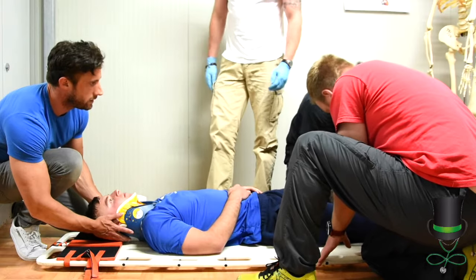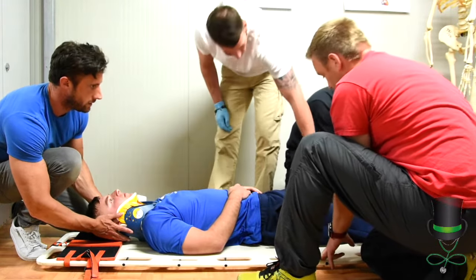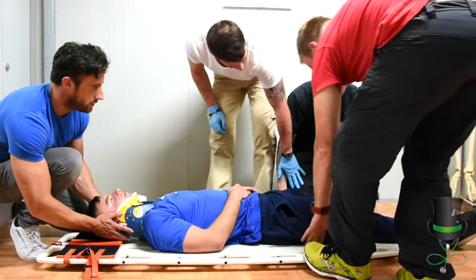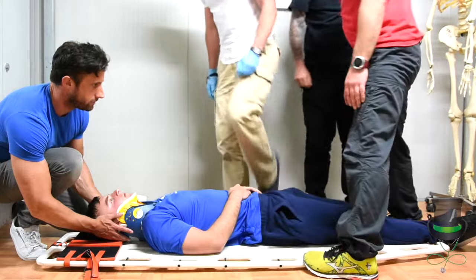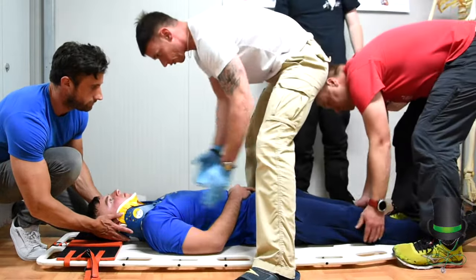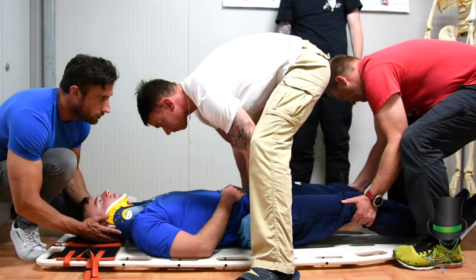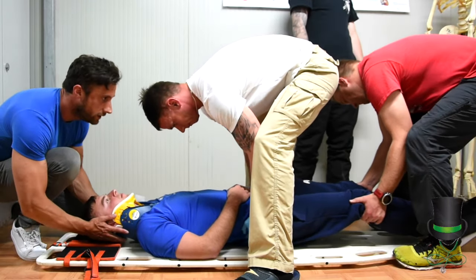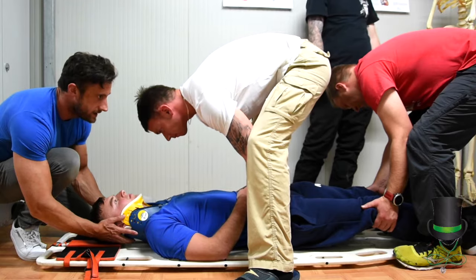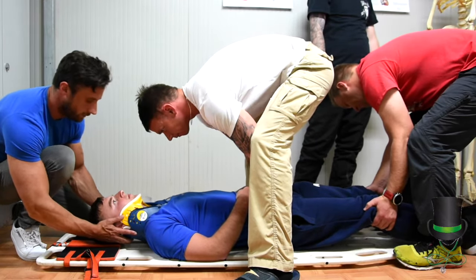This will take standing over the patient, and again the guy at the head will control the movement. We're going to slide the patient straight down and then straight back up to centrally align him. When I say move, we're going to move him down one inch; when I say stop, we will stop. Prepare to move and move. Stop. Same again — prepare to move and move. Stop.